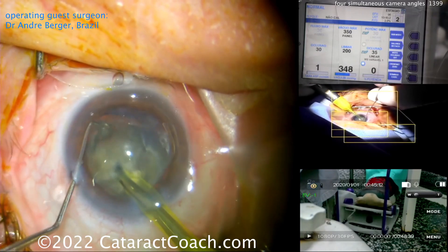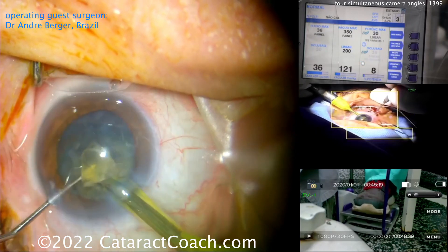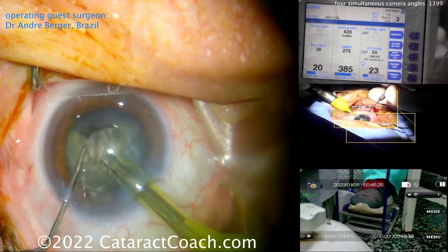Notice the chop didn't propagate all the way through — that's okay, because he's going to make quadrants out of it. Very nice technique. Notice how the eye stays in primary position. At the beginning of the case the incisions were made very quickly, but look how perfect they are — fantastic tunnel length, very even, very well done.